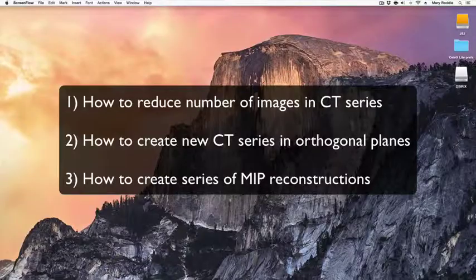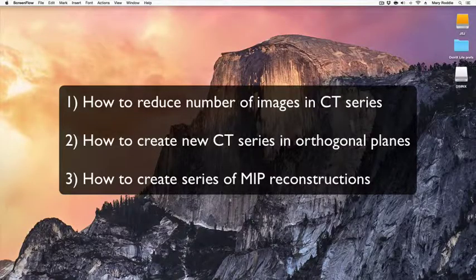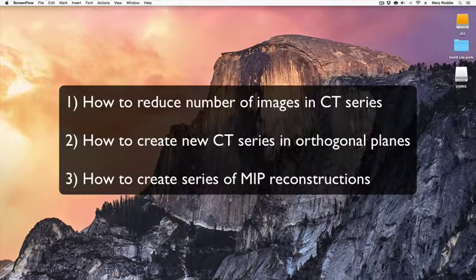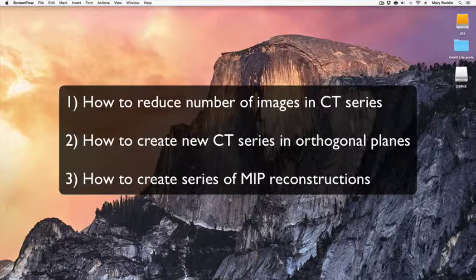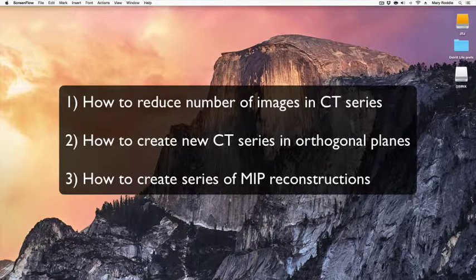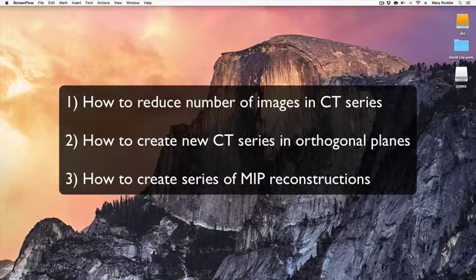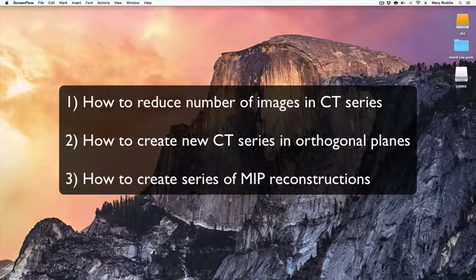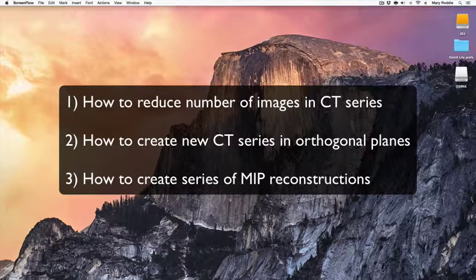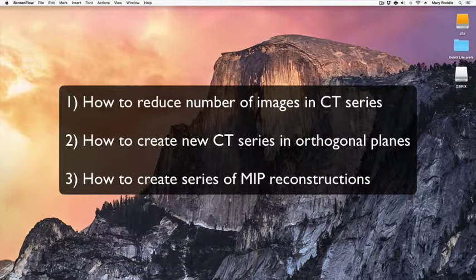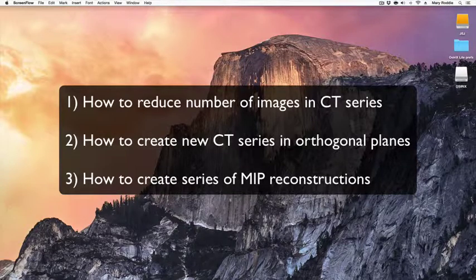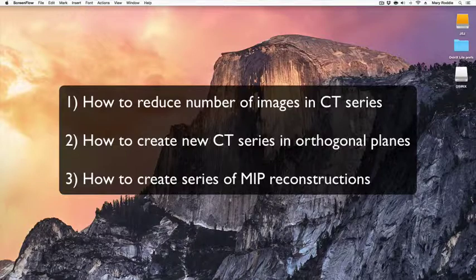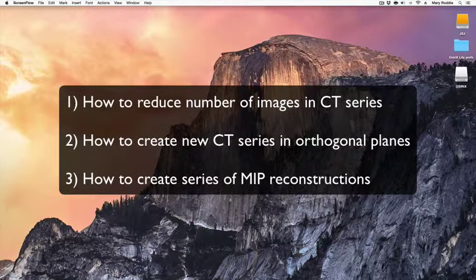In summary, this revision session has covered different ways to reduce numbers of images in CT series imported into OSIRIX Lite for teaching purposes, the creation of new series of CT images in different orthogonal planes, and how to create MIP reconstructions. I hope you found that helpful. Thank you very much.